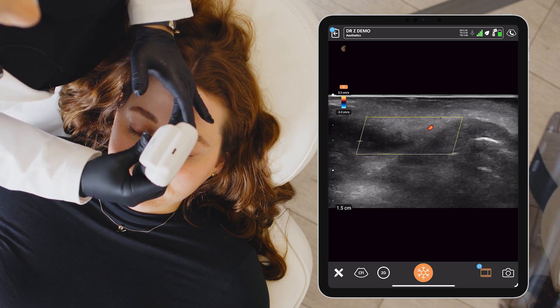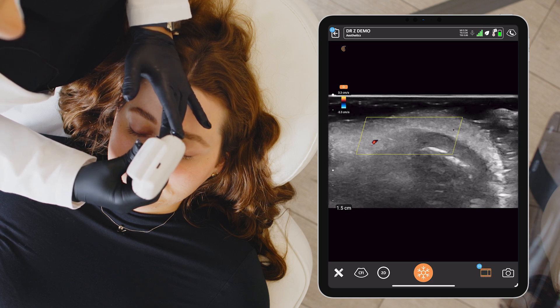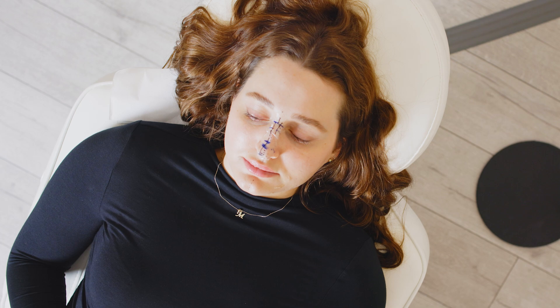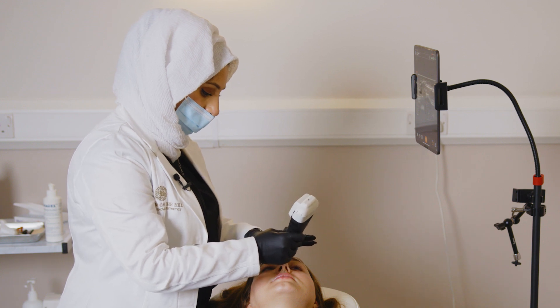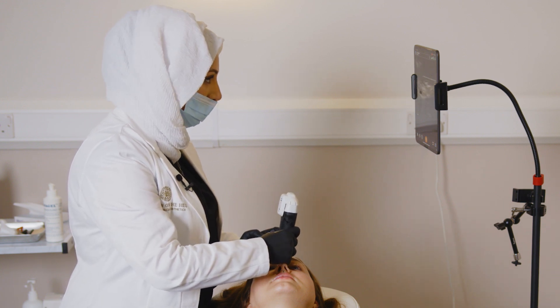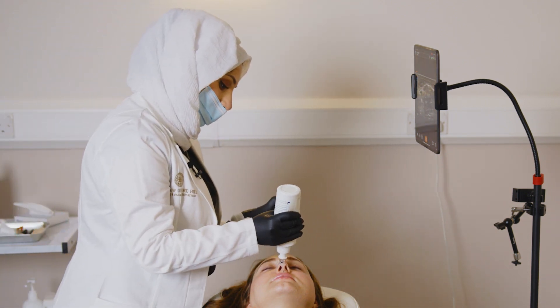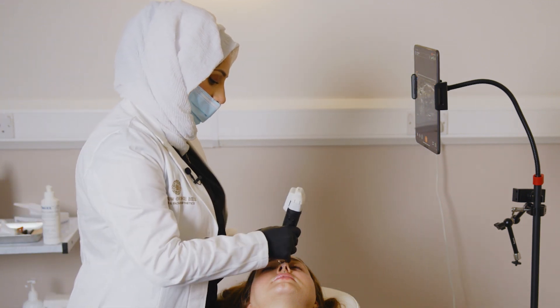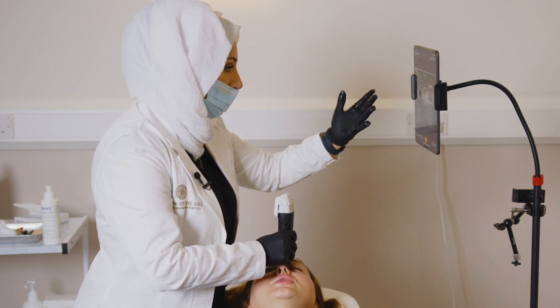I'm okay with injecting the tip with a very small amount, but is there any need to inject that unless we're doing the full nose? We have to come back to the tip and decide if it's safe. The top part was very vascular and not really very safe to inject. The tip of the nose was a bit safer. The question is, do you still want to inject the tip of the nose if we're not going to mask the bump? No — I can't proceed.